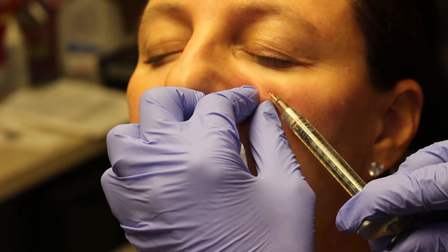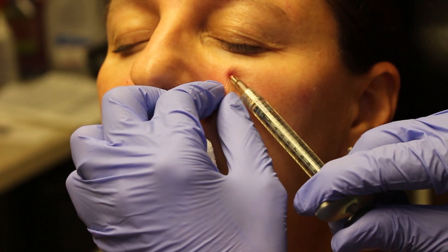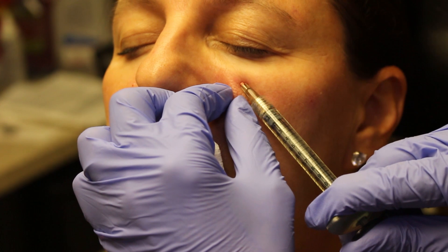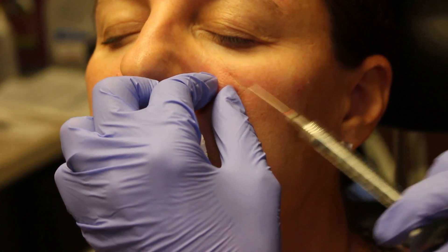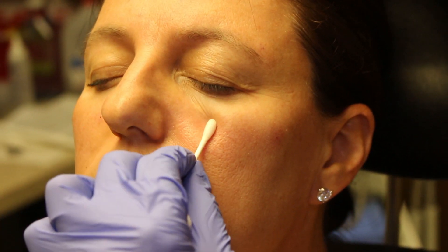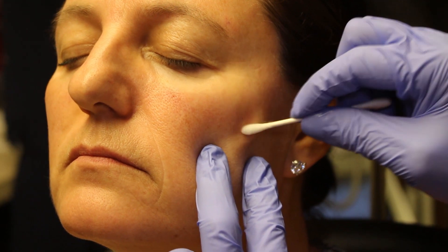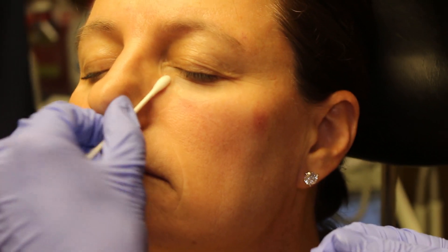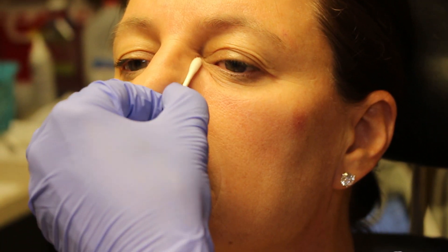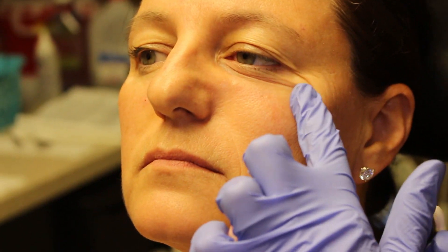Just a little retrograde threads. That's all we need to do. So barely any marks. Then what we're going to do is we're going to roll this — let's see, we have a little bit of product right there. We poke, we're going all the way to the bone.